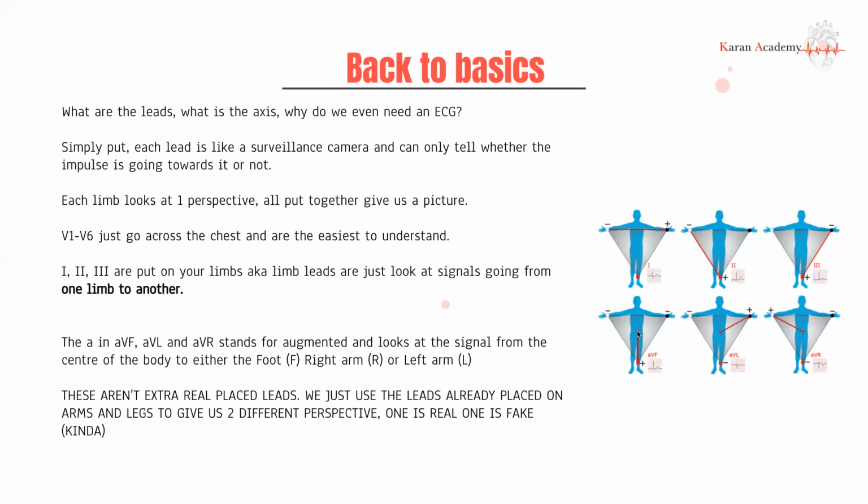And now these just look at the heart's activity in the down direction, in the superior lateral, yeah, so superior lateral on both sides, one's to the left, one's to the right.